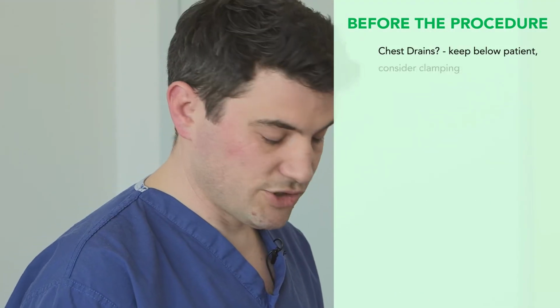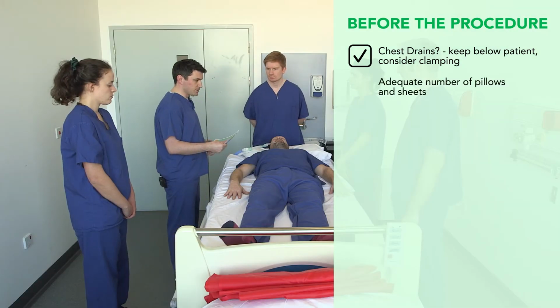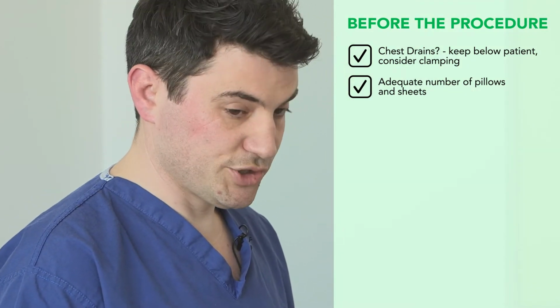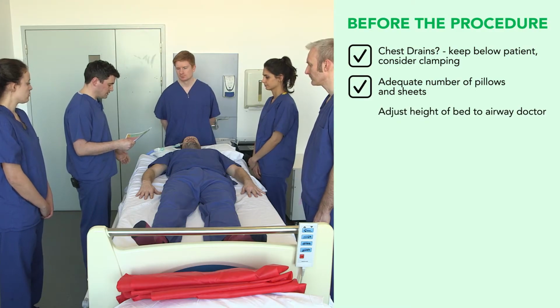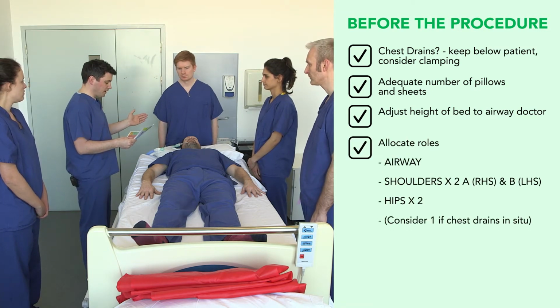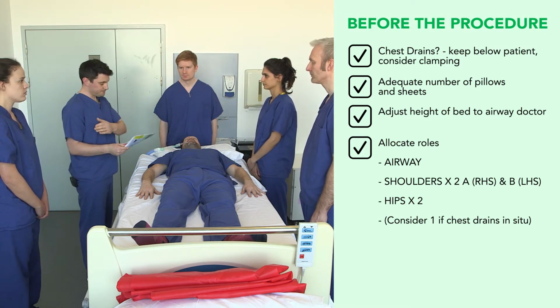If the patient had a chest drain at this point, we'd consider clamping or keep below the level of the patient. We need to establish that we've got an adequate number of pillows and sheets. So we need 2 pillowcases, 4 pillows, an additional sheet and a sliding sheet. In a moment, we'll adjust the height of the bed to the airway doctor, and we'll allocate roles. So we have 1 airway doctor, we have shoulder person A on the right hand side, shoulder person B on the left hand side, and 2 people on the hips.